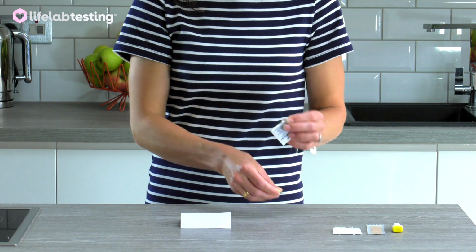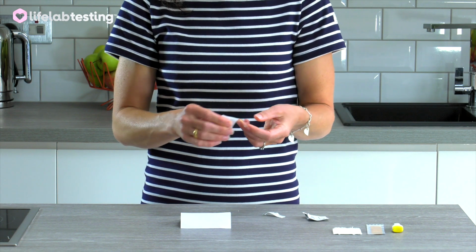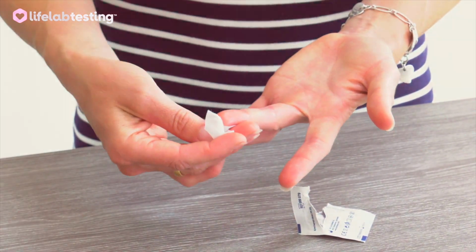Remove the provided disinfectant cloth from its film and use it to disinfect the entire tip of your index or middle finger. Wait approximately 15 seconds for your finger to dry.